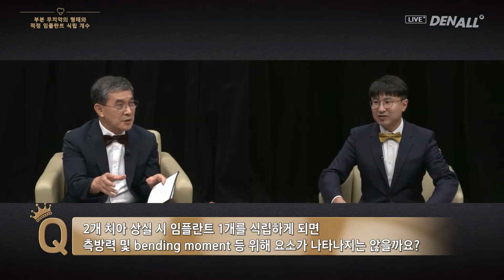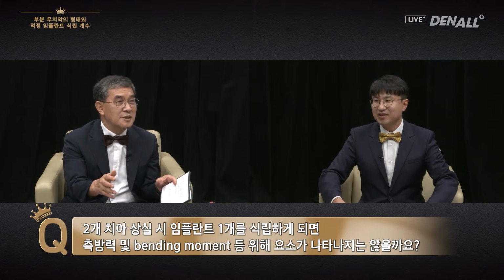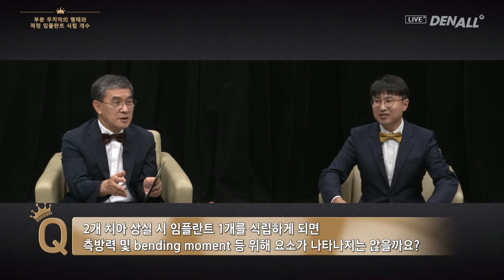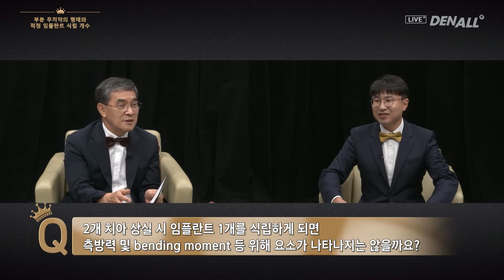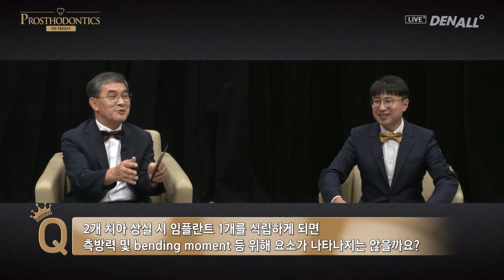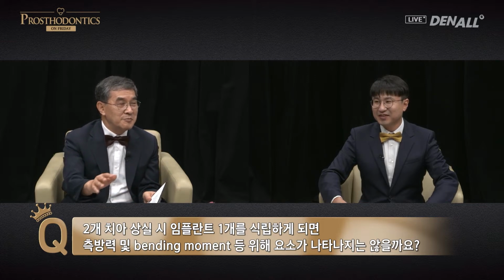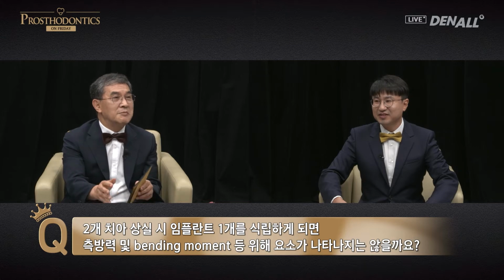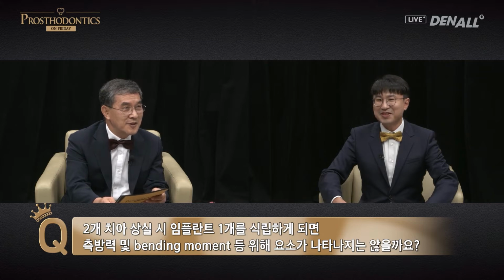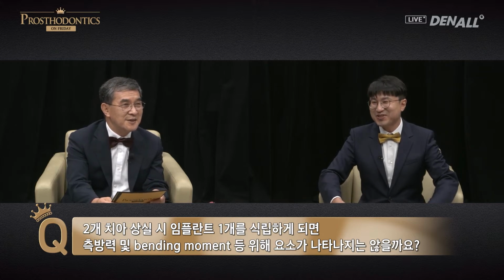As you have mentioned, if there's a sufficient amount of space, say over 12mm, you can place 2. However, if there's insufficient space, rather than placing implants too close to each other, having more leg room in terms of space is better for implant longevity. Is that correct? Yes, you have summarized it perfectly. Thank you. As implants transitioned from smooth surface to rough surface, implants have developed significantly, and this has become possible. Is this correct? Yes. I didn't know how to summarize it, but you have done it wonderfully. Thank you. Please carry on with your lecture.